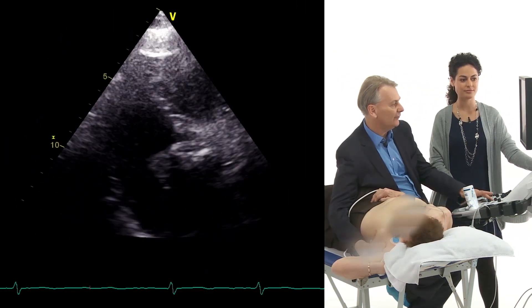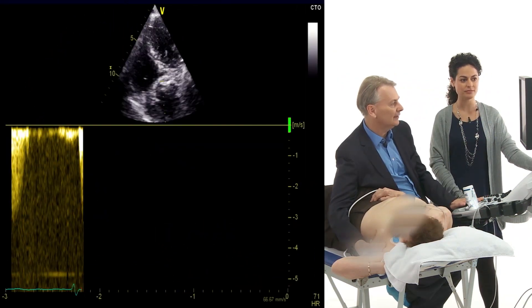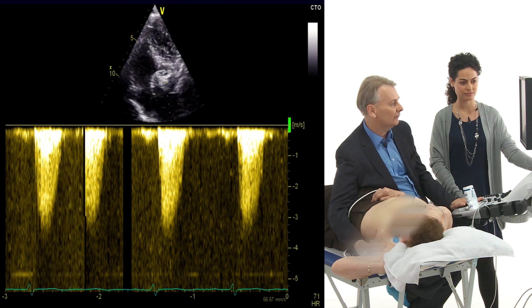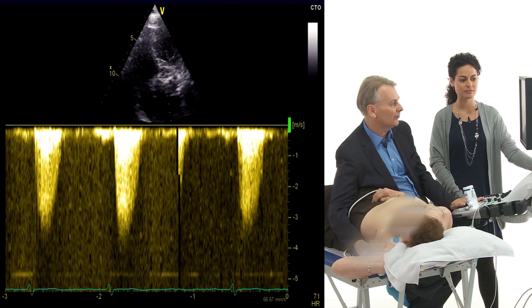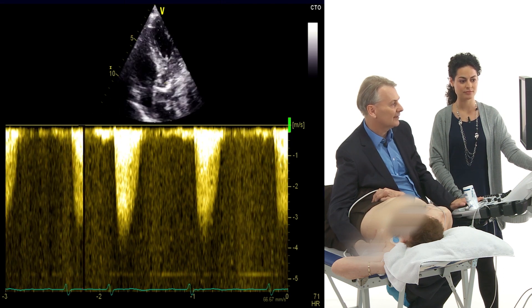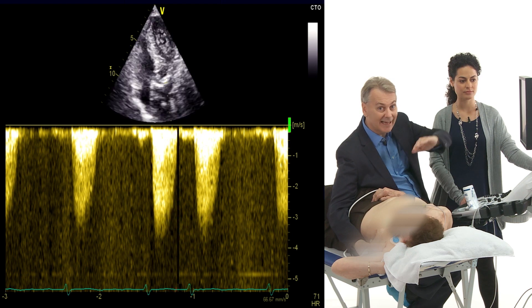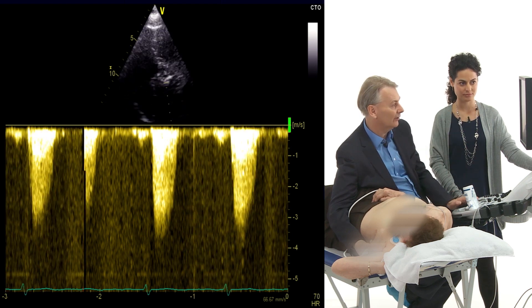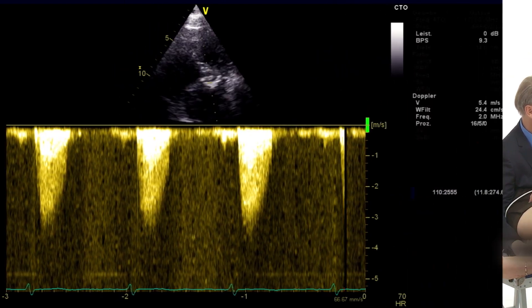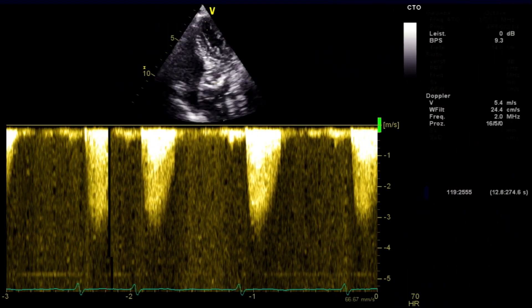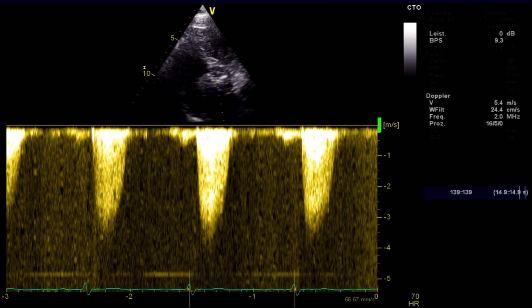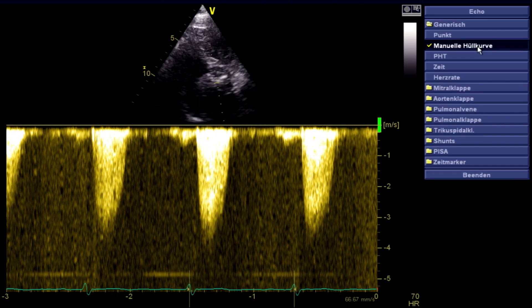We do that in a five-chamber view, ideally so that we are better oriented to the flow of blood through the stenotic valve, so that the septum is usually slanted a little bit the way you have it in our view right here. Then you put the continuous wave Doppler through and simply trace the curve.